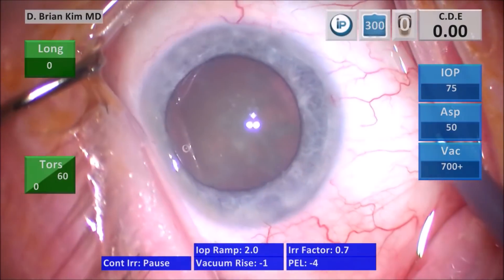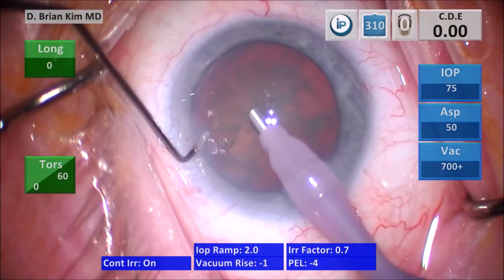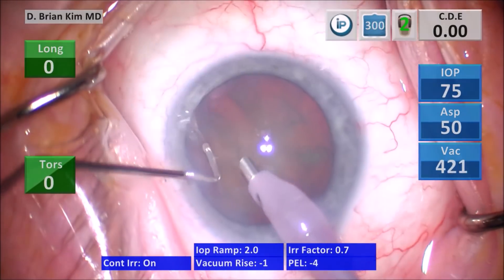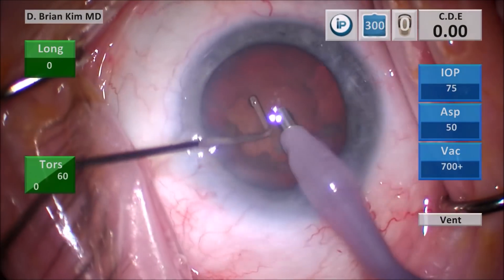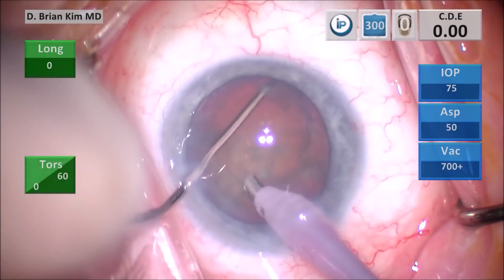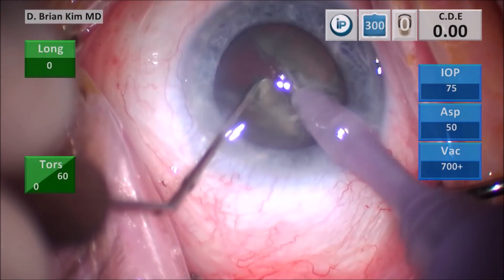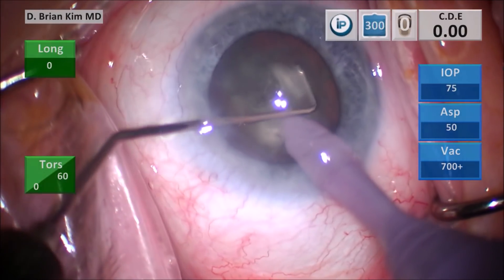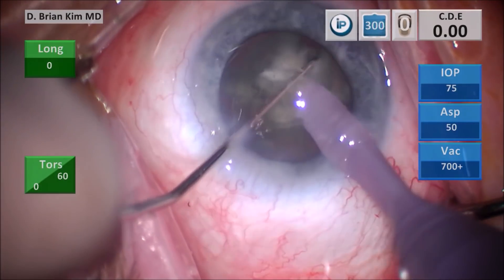I lift the corneal incision with a chopper and then place the phaco tip, but I'm not initiating any irrigation until I'm in the eye. This helps reduce the risk for descemet detachment. I'm aspirating the soft surface lens material before initiating the double-chop. I'm placing the chopper out to the equator and then placing the phaco tip sub-incisionally. I'm placing the instruments fairly vertically, and then I place the chopper out contra-incisionally — this is the cross-chop maneuver.